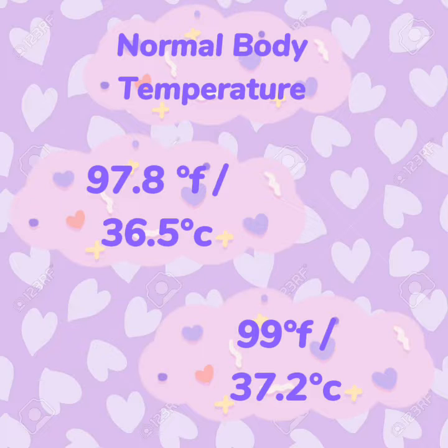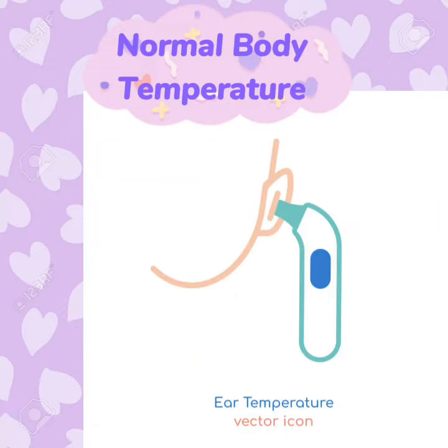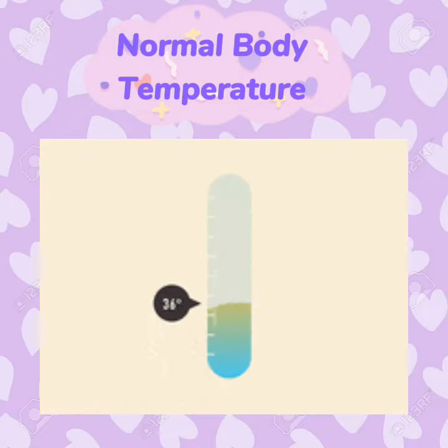A person's body temperature can be taken in any of the following ways. These are orally, rectally, axillary, by ear, and by skin. Body temperature may be abnormal due to fever or high temperature, and hypothermia for low temperature.